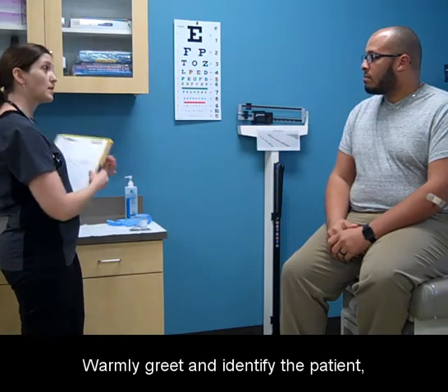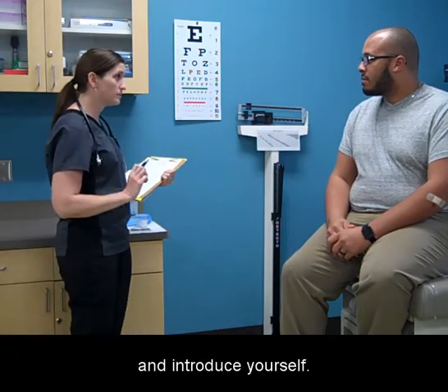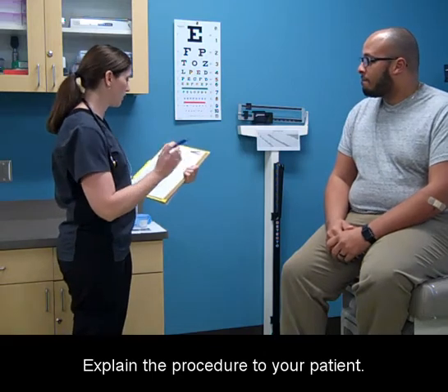Warmly greet and identify the patient and introduce yourself. Explain the procedure to your patient.